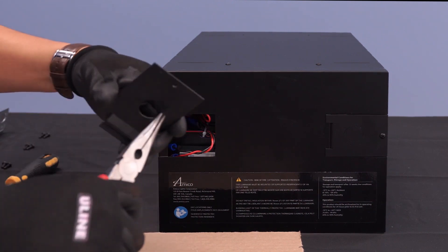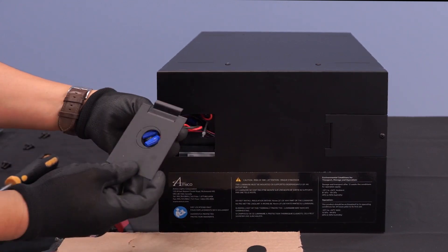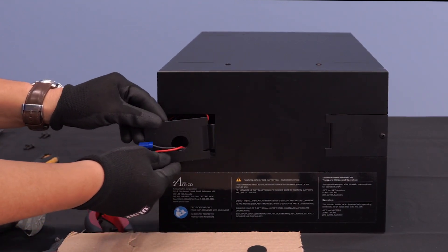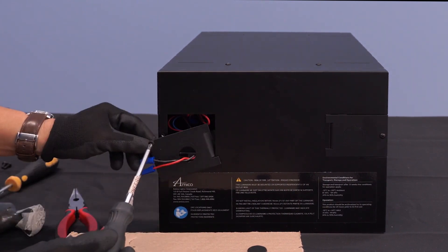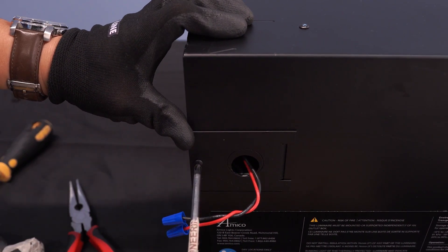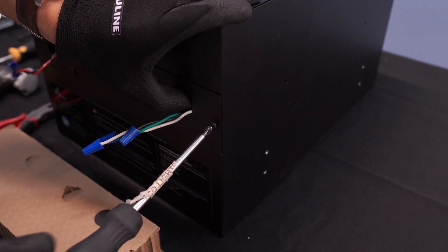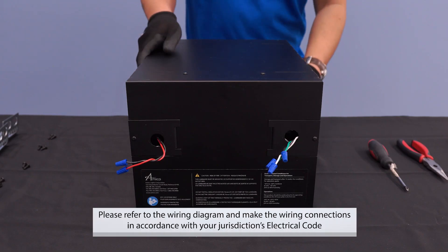Carefully detach the inner portion of the knockout with a pair of long nose pliers. Feed the high voltage and low voltage wires through the respective knockouts and re-secure the conduit door to the NOVA box with your Phillips screwdriver.